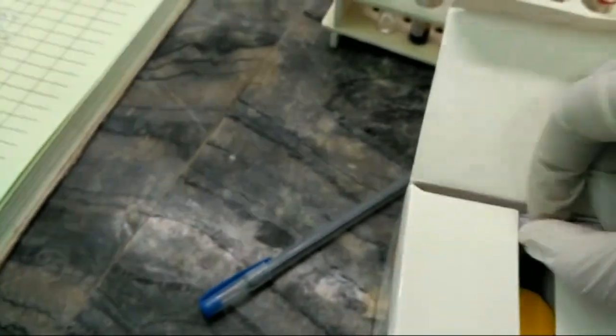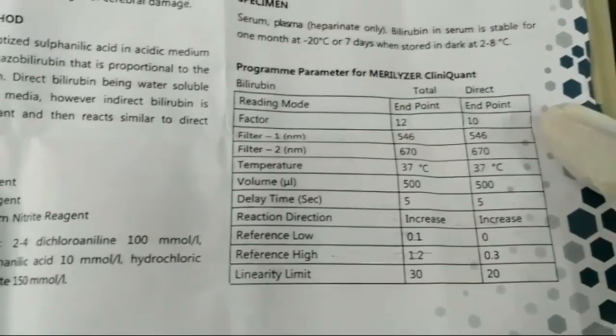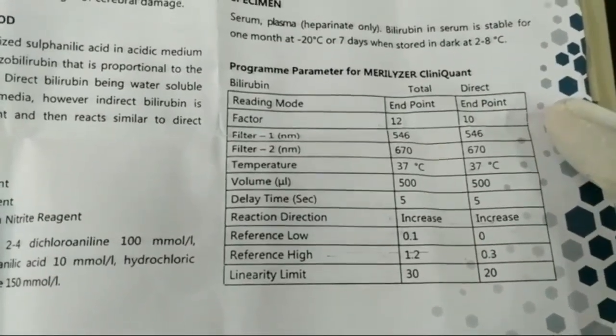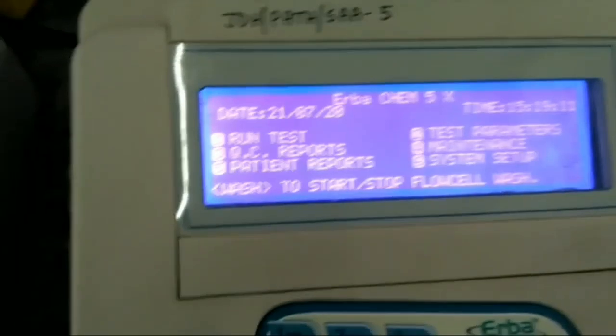For this, you first have to open the reagent and open the literature inside the reagent. Inside this literature, the total program procedure is described.